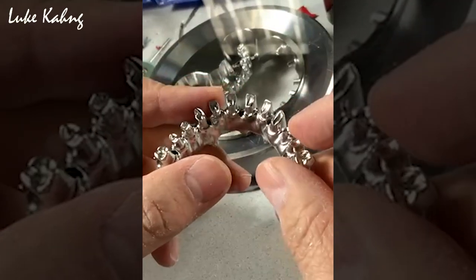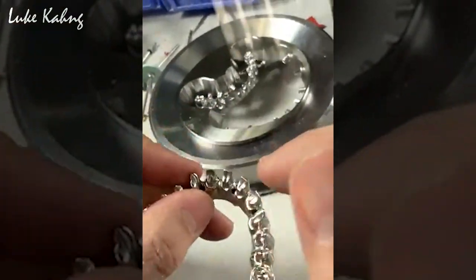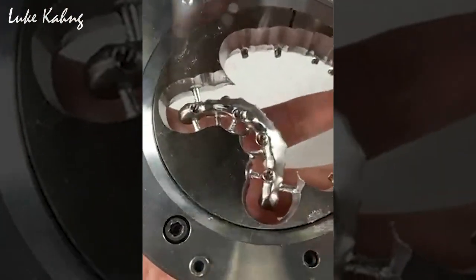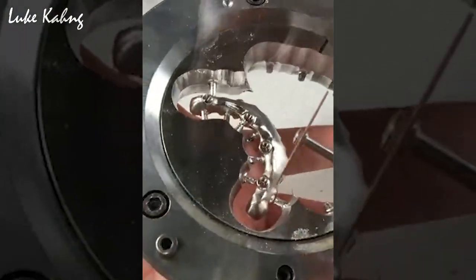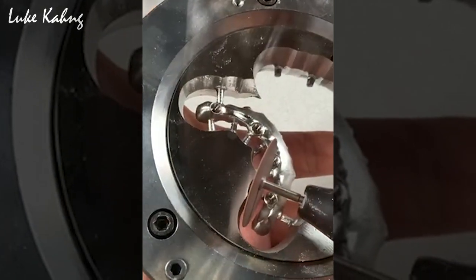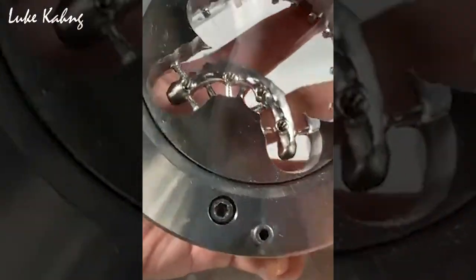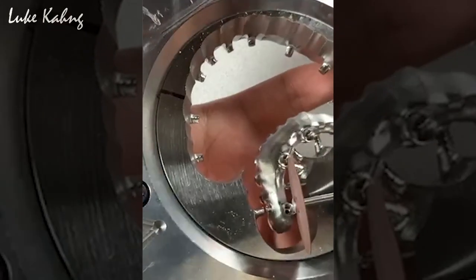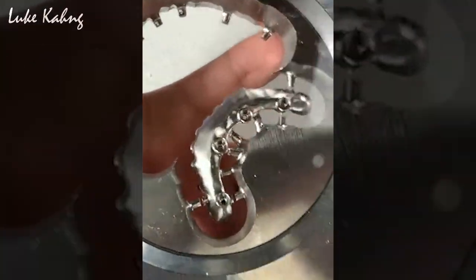That's why we can try to finish this one. Okay, so now the top, and then here's the lower. So I've got two more.